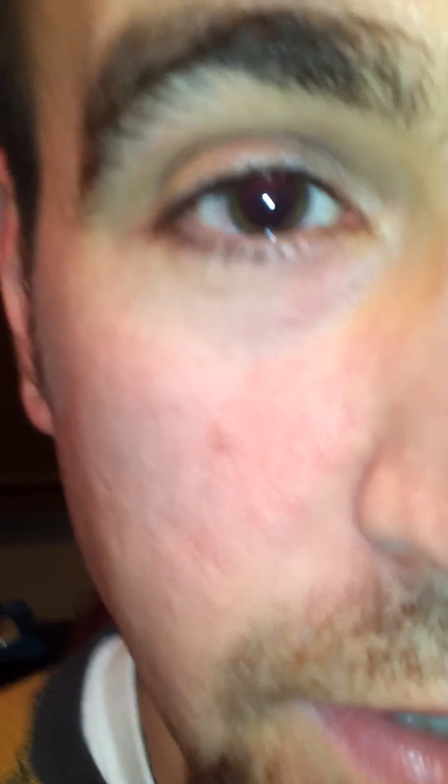You can see I'm in my bathroom. I have my 20 diopter lens and my cell phone. I'm going to turn the camera around. As you can see, I am dilated and I've got my lens right here.